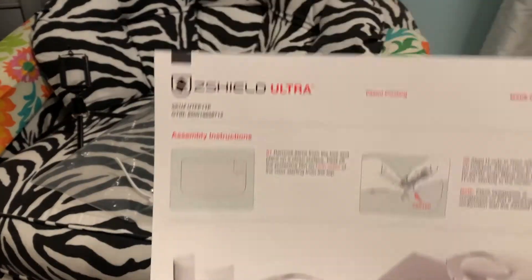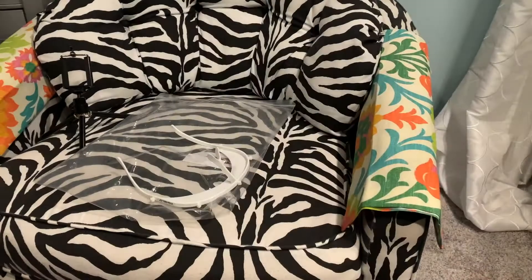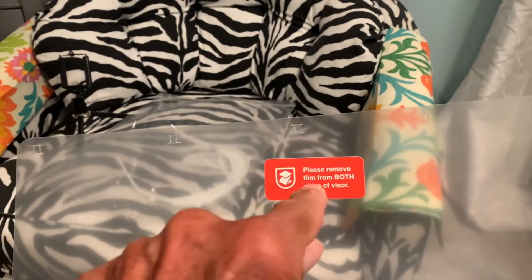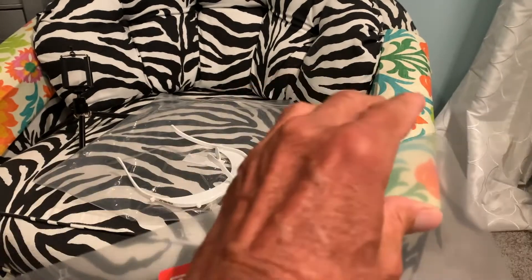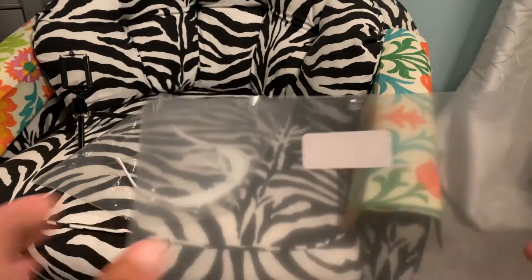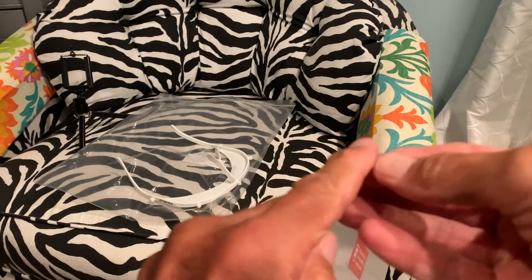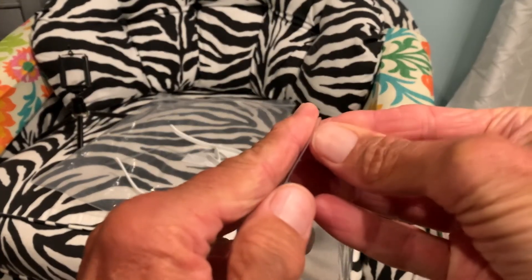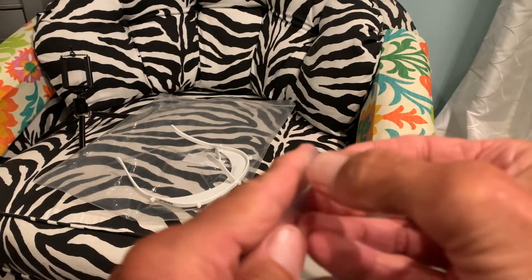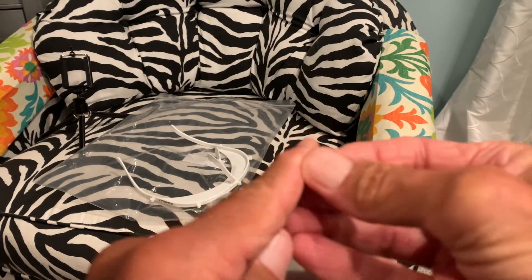I got this on Amazon. All right, so first you have to remove the film from both sides of the visor. I think we can do that. There we go — there's one side.